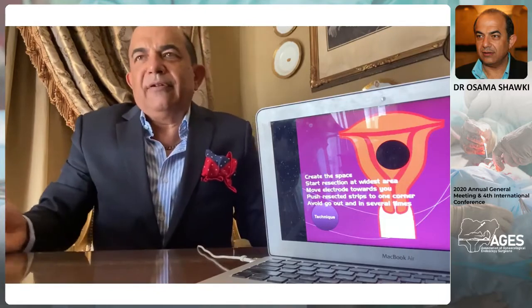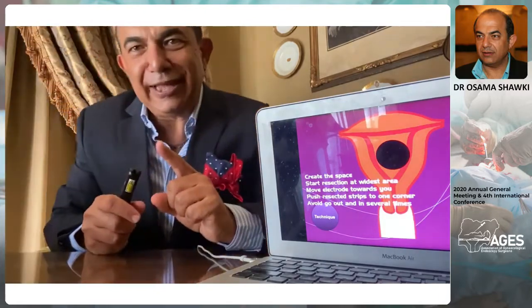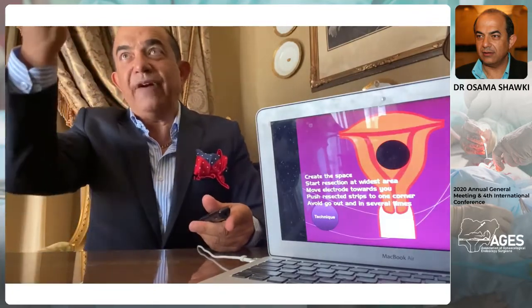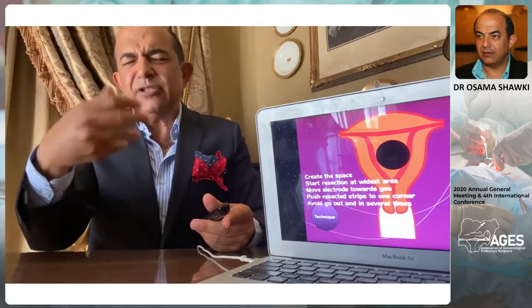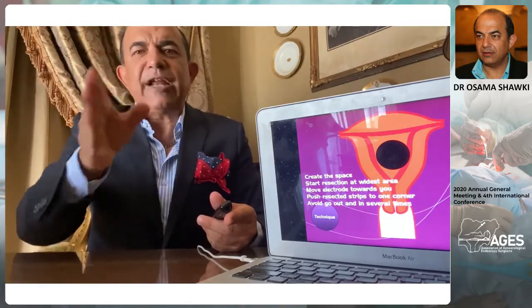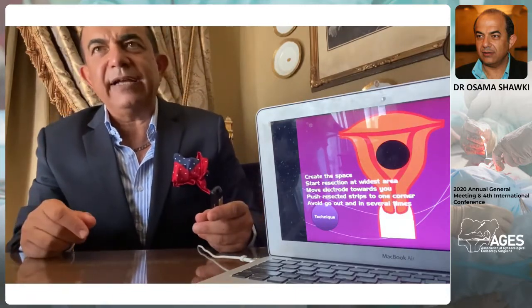So, Osama, we are confused. How could we know the pressure inside? Only one thing can tell you. If you start cutting into a myoma and you find bleeding happening, not terrible bleeding, but some blood is leaking, then you are definitely at an intrauterine pressure less than the arterial blood pressure. You are less than 100, definitely. Exactly how much I cannot tell, all right?